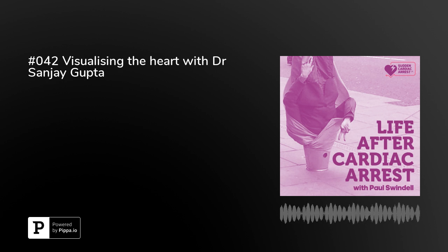It doesn't require very, very highly specialized training, just because it's so much more accessible. So echocardiography is the kind of staple investigation. And from my perspective, the first test I would do if I was worried about someone would be an echocardiogram. If they have a strong heart, I feel relieved. If they have a weak heart, I get more worried.